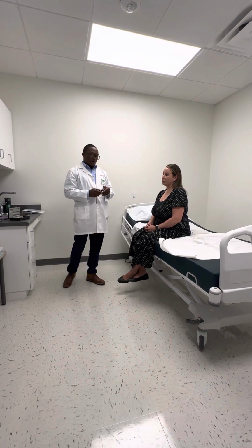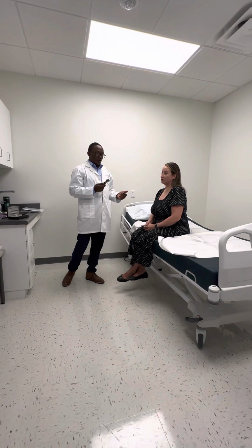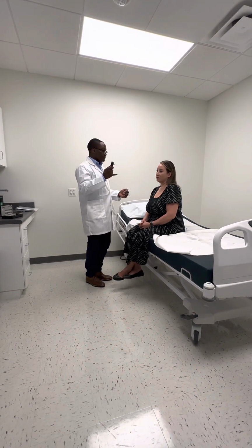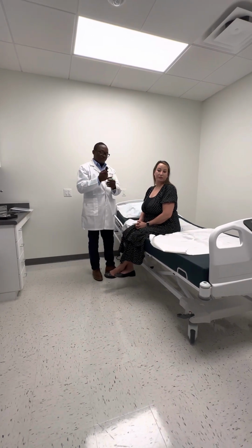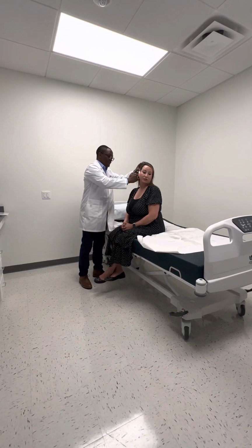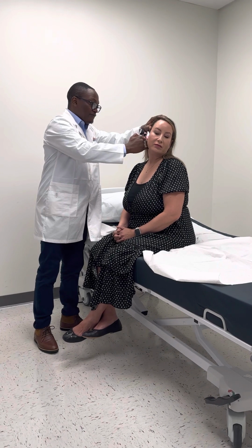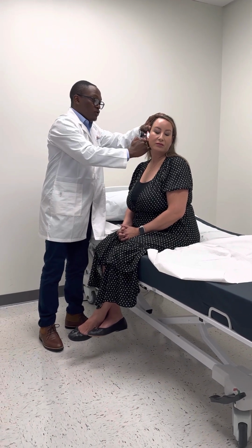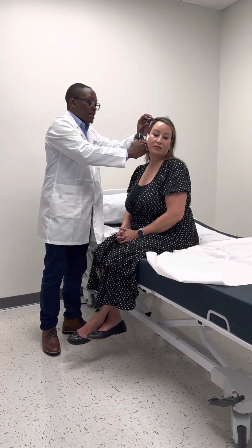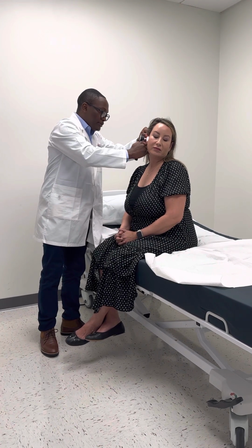So the technique on using the otoscope: I'm going to have a firm grip, and my last finger, the little finger, is going to be against the face of my patient, and my other hand holding firmly. So if she moves, it's going to move with me, so I don't cause any trauma to my patient. So I'm going to pull the pinna backward and up.